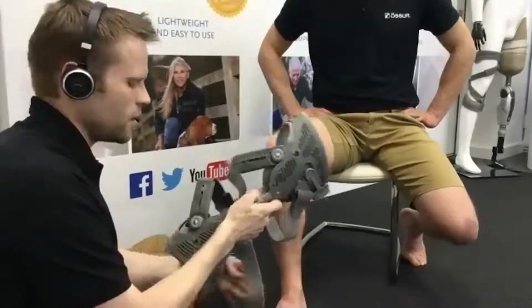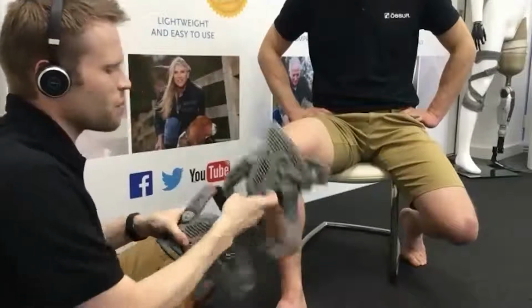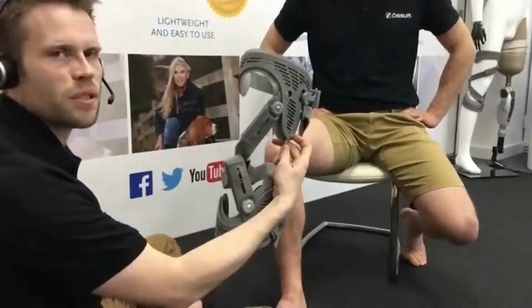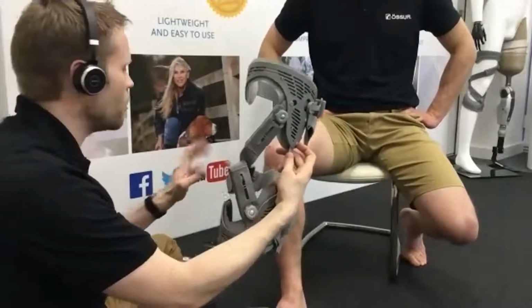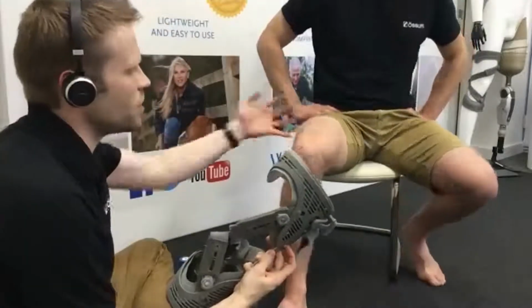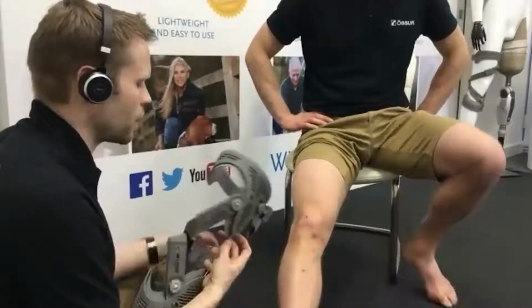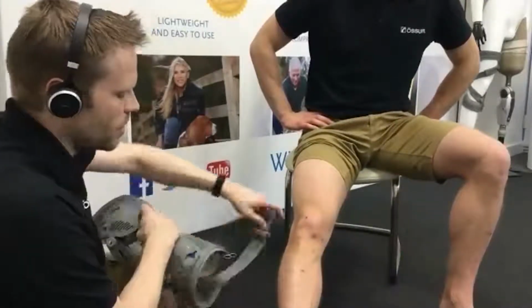And with this, let me just adjust this one quickly. You can see the straps are pretty long, so we need to make some adjustments to that before we start. So what we're going to do is get our patient in the correct position. Often you need them to slide forward a little bit and then just straighten the leg like that. Okay, so I'm just going to undo the brace either side.